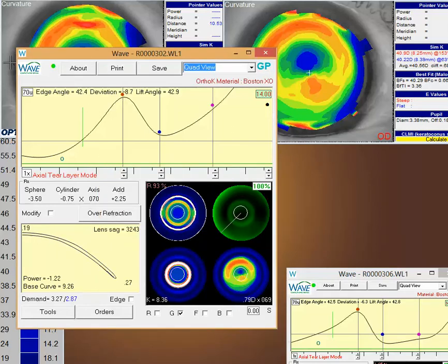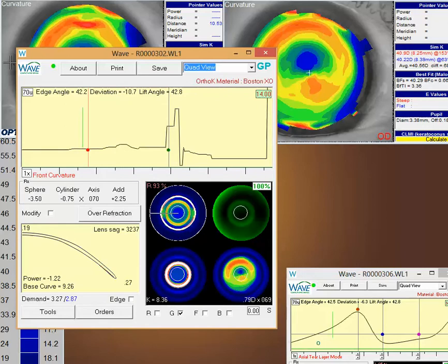And then you also mentioned the add. Now, if you remember, you look at this top one for the add. Based on the two lenses that you sent over, the right and the left, I'm assuming the right eye is the more dominant eye because the pupil size is a little bit bigger on this lens. And one of the things you'll find in these mini-scleral lenses, they really don't move very much. So sometimes it's hard to get into that reading portion in a distance center lens.